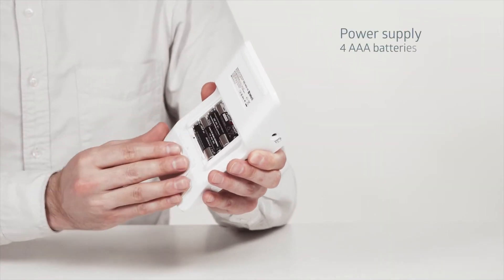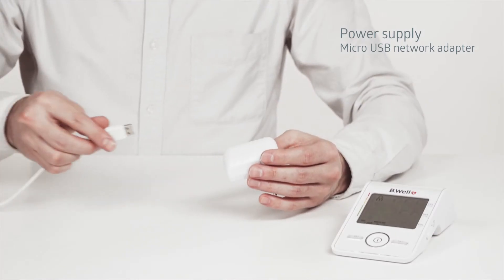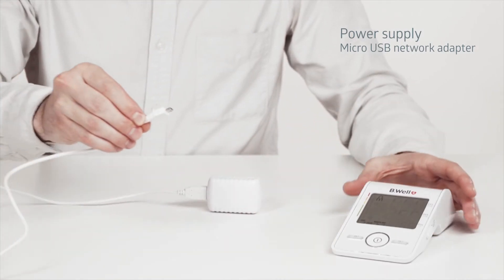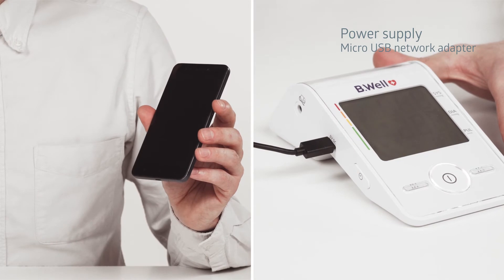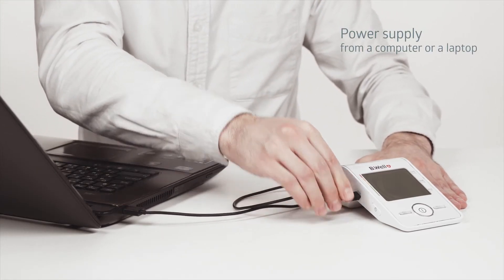The tonometer can be powered by four AAA batteries or from the network via a standard micro-USB network adapter. You can use a Be Well adapter or a phone charger. The Be Well tonometer can also be operated from a powered computer or laptop.